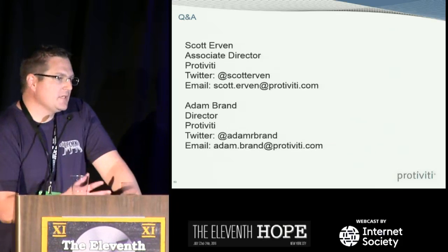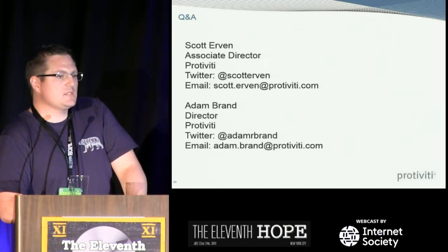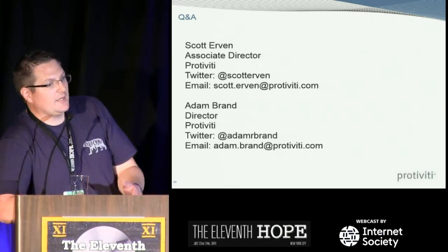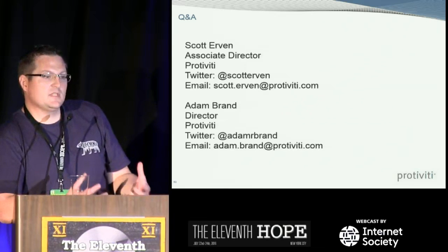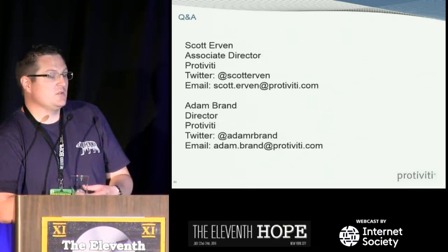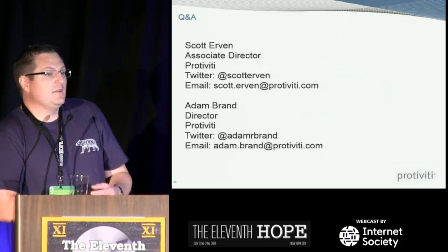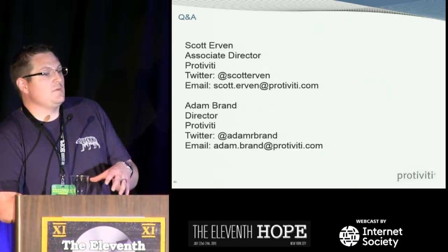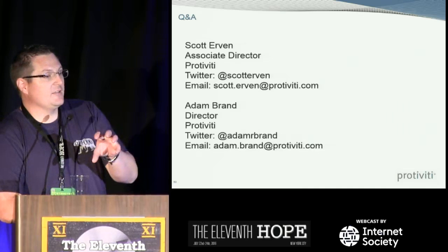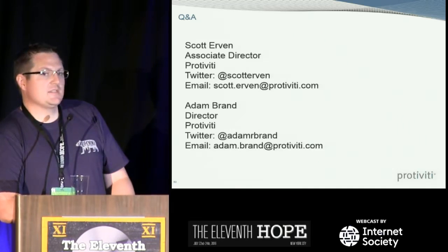And insulin pumps, I think Jay Radcliffe has done that. Barnaby Jack kind of showed that as well. So that's there. I think with insulin pumps, it's interesting. There's this idea of artificial pancreas and kind of continual loop, and now you have these systems in development that are going to do a lot clinically for people, right? I mean, bottom line, it's going to help a lot more people than it harms. But the risks of that are you have the pump talking to the glucose monitor, talking to your smartphone, and it's a full relay, and data integrity becomes an issue if you can compromise that, because the system's automatically treating based on the software.